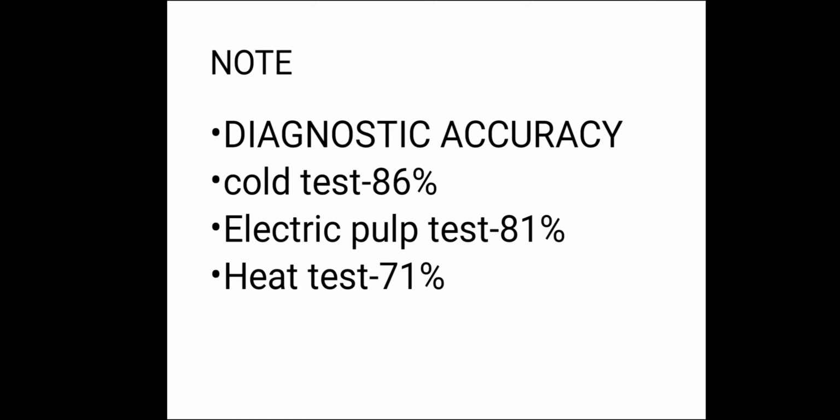Diagnostic accuracy. Cold test is said to be the most accurate, which is 86% accurate, and electric pulp test is 81% accurate. Heat test is 71% accurate.